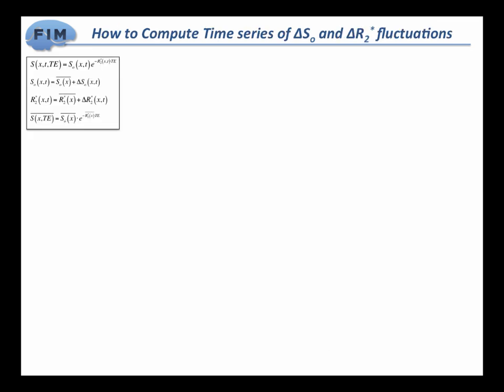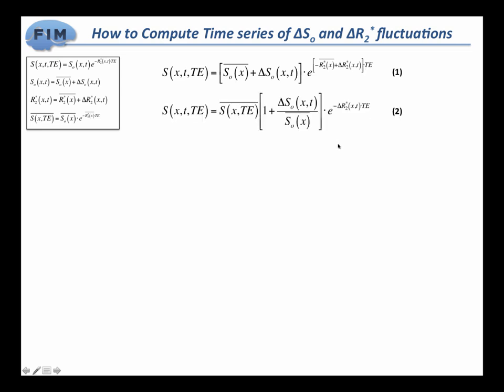What we're really interested in in fMRI is the fluctuations, the other term. So if we put again the same formula that we have here, where is the mouse? Here. But we substitute this by these two terms and substitute this one by these two terms. We have this. It's a little bit bigger, but it's just that. The next step is to take this definition that contains the mean values and put it apart. So we have extracted it and we have this new formulation. It's just algebra, moving things around. There is not that much.